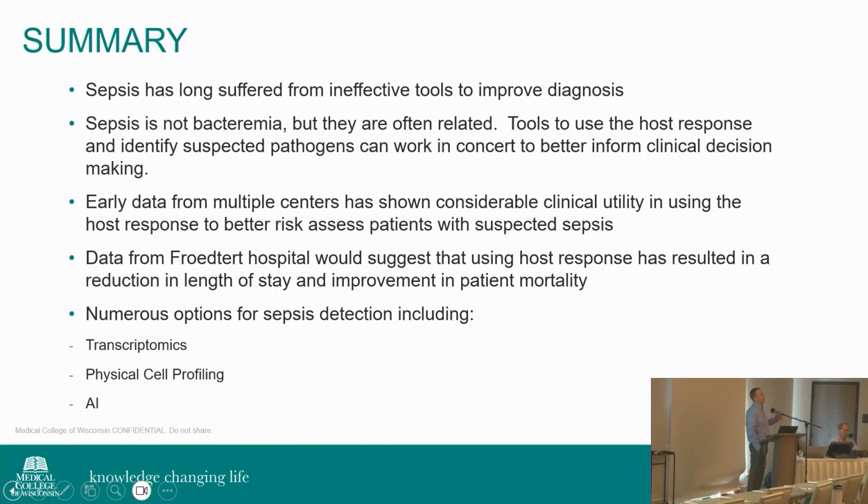So with any of these tests, this is not a simple 'I'm making this test available, go use it' thing. One of the key things that we've really learned is there's a lot of education and physician and nurse feedback that needs to take place as you're implementing this, so folks really get comfortable with it, they understand the results they're going to get, and they can act on those results.